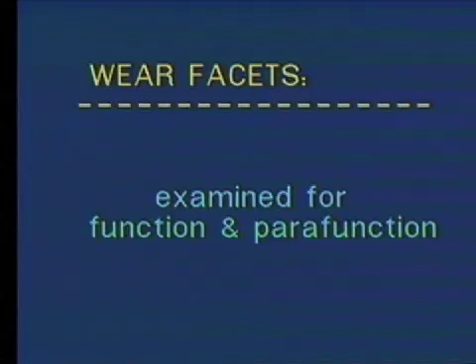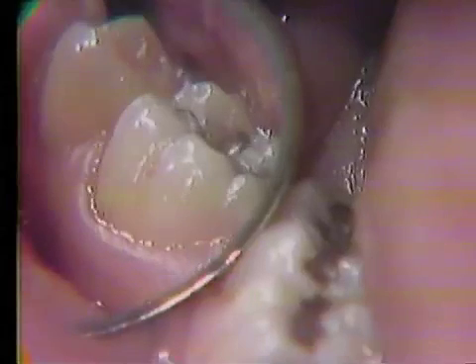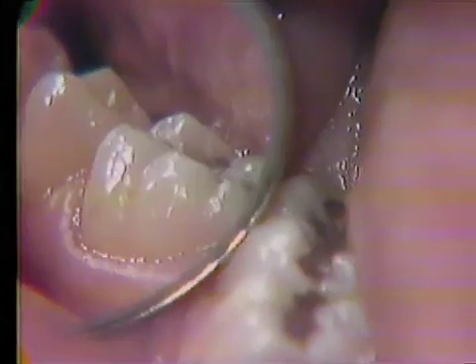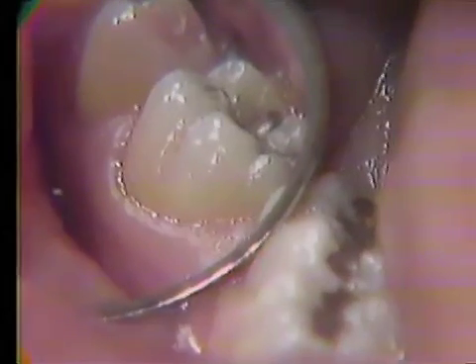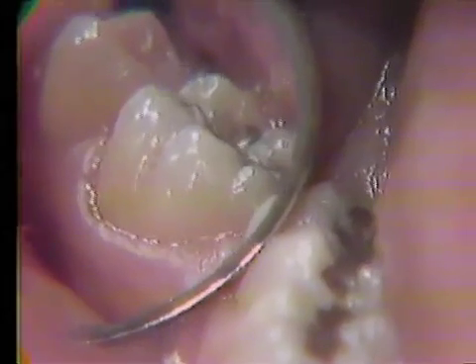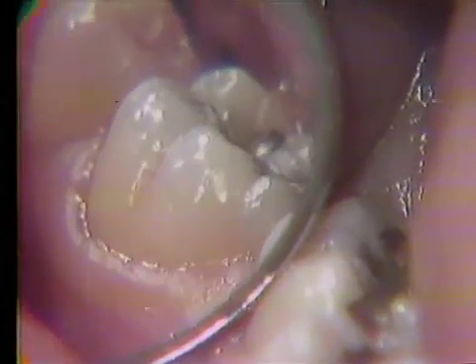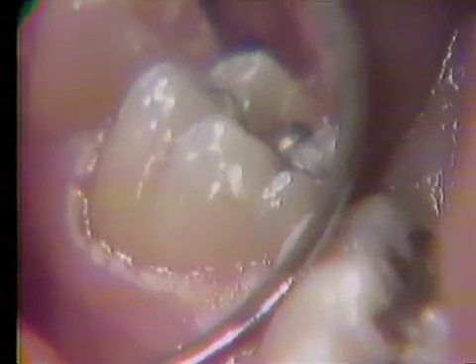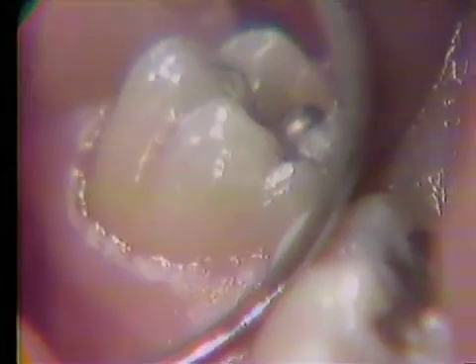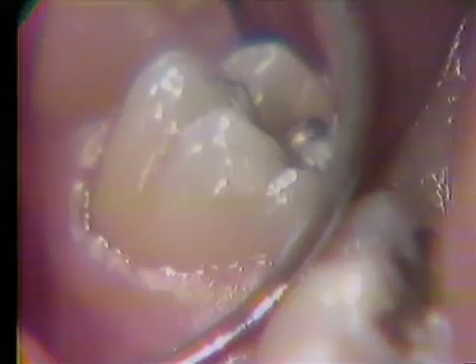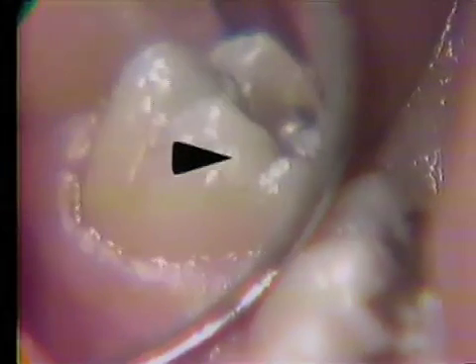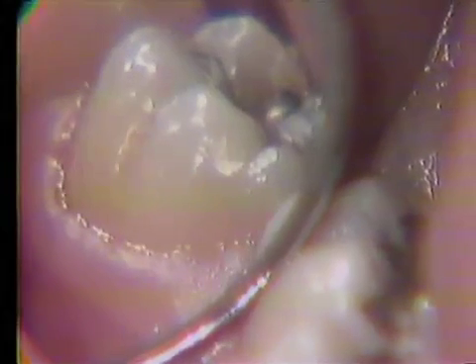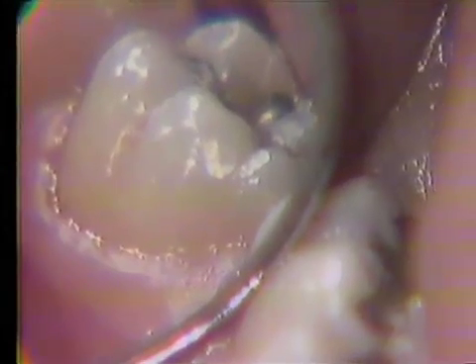Four wear facets will be demonstrated. The first wear facet is on the mandibular right first molar. Since wear facets are smooth and flat, they do not mark well with articulating paper. Light reflects from wear facets and will be used for demonstrating the areas of interest. The wear facet on the distal buccal incline of the distal buccal cusp contacts the opposing tooth in central occlusion and during the first part of the right working movement.